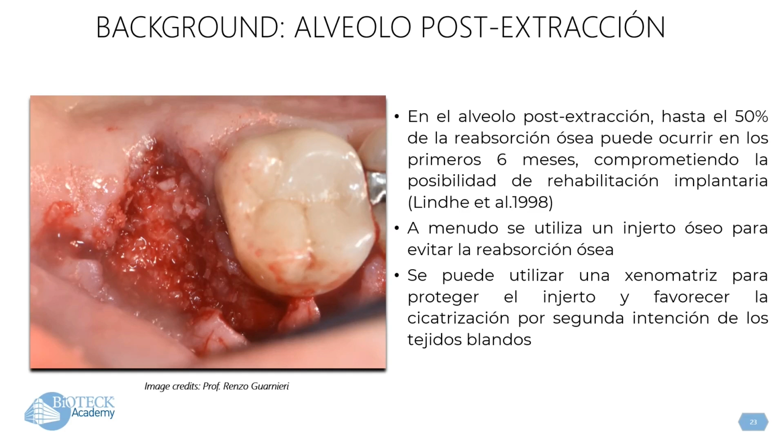And from a surgical point of view, this is better, because we have also in this case less possibility of post-operative complication.